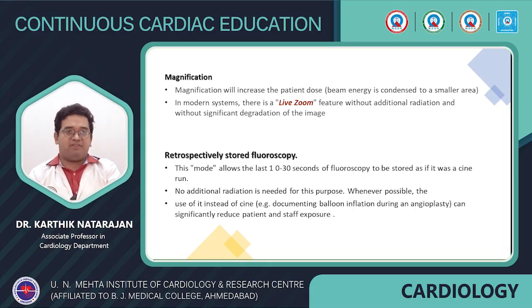Magnification. Now magnification will increase the patient dose, and there is something known as a live zoom even available in our labs, which will prevent further radiation exposure. You can also use retrospectively stored fluoro, and this mode allows the last 10 to 30 seconds of fluoro to be stored as if it was a cine run.